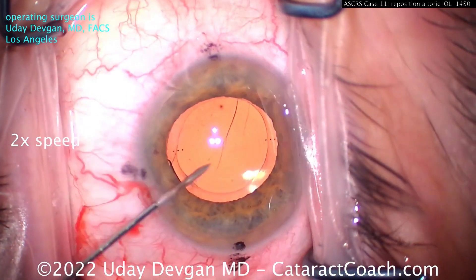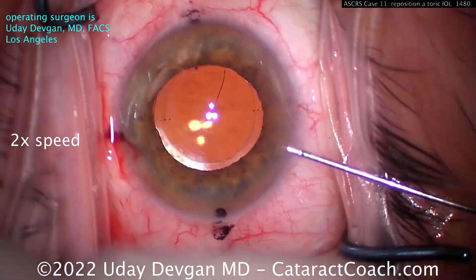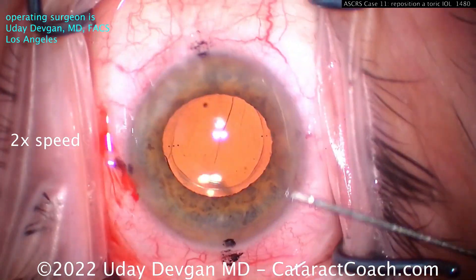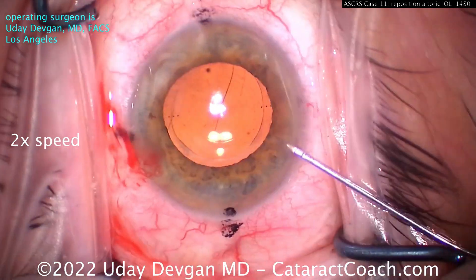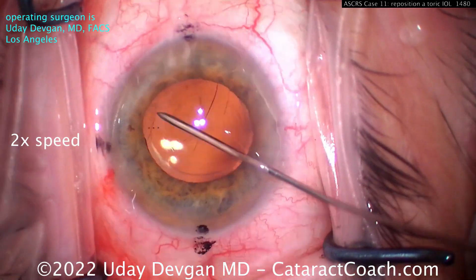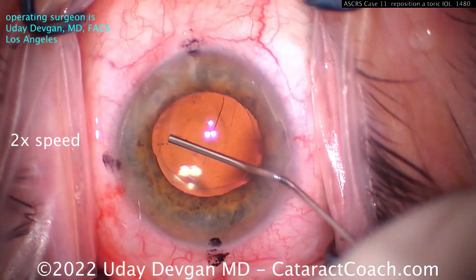No more than that. Now we're going to get the viscoelastic on the needle and get under that rhexis edge. Use a 27-gauge sharp needle — bevel down — on the viscoelastic, dispersive viscoelastic in this case, to get under that rhexis edge all the way across. Don't damage the capsule. Just create a little bit of a gap and eject the viscoelastic.